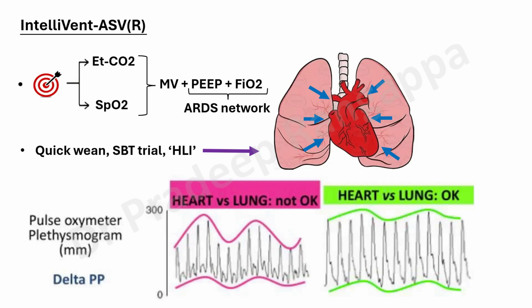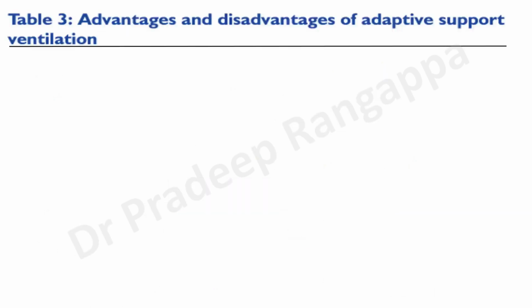It's like pulse pressure variation or stroke volume variation. It looks at hemodynamic disturbance contributed by the respiratory variation. And obviously, if you have huge swings, then you know there is a lot of hemodynamic disturbance due to the ventilatory settings, and there is some auto adjustment to compensate for the heart lung index. So this is there in IntelliVent ASV.